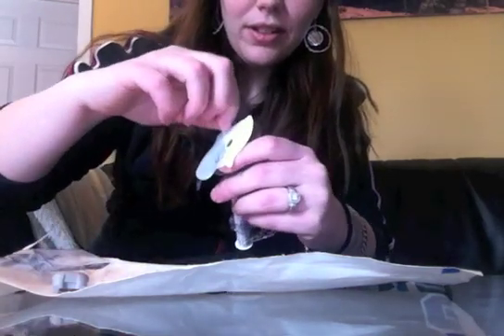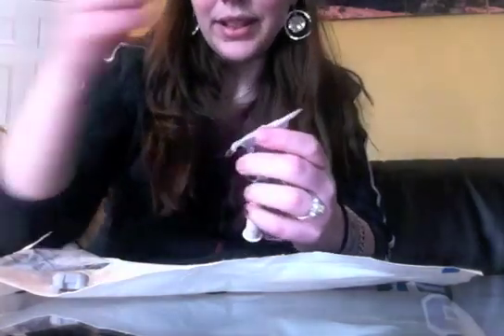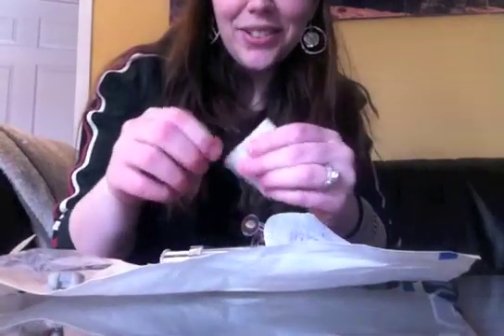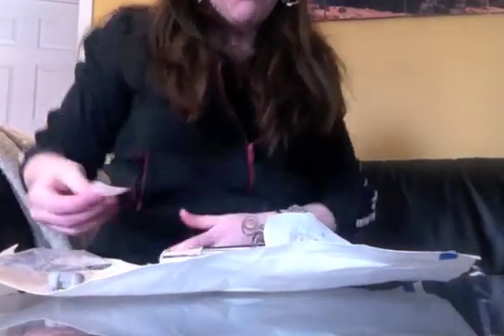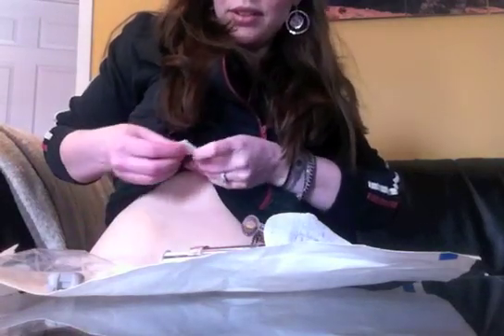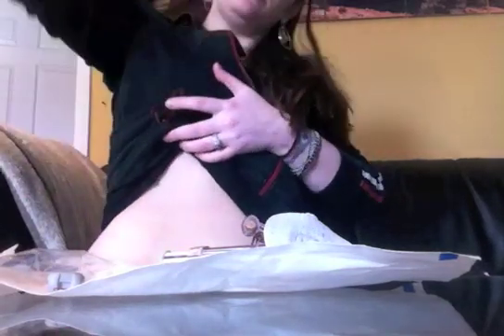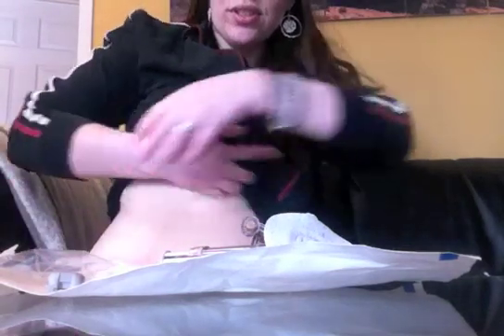To start, you just grab these little tabs and rip them off. Of course, I forgot to wipe myself down first — so use your alcohol swab. I'm going to put it on my stomach right now, so wipe the whole area down.